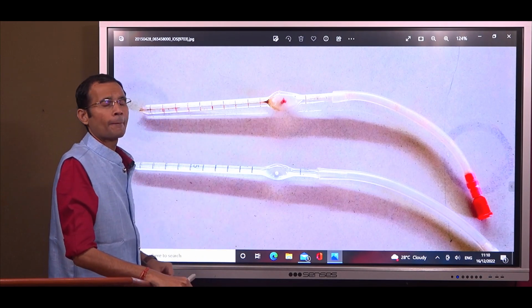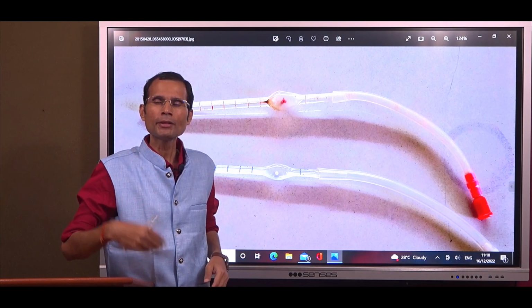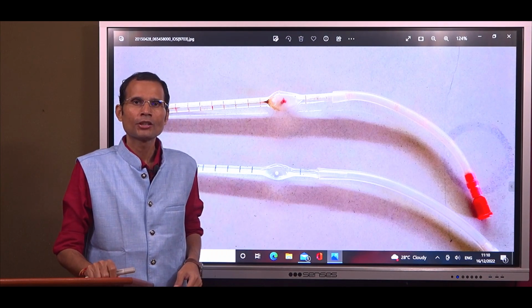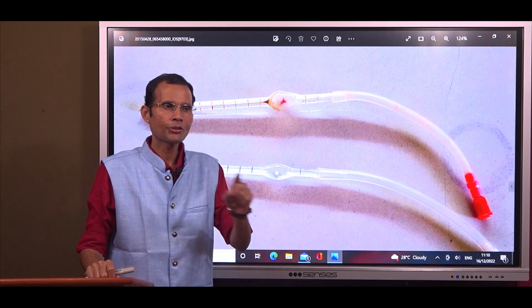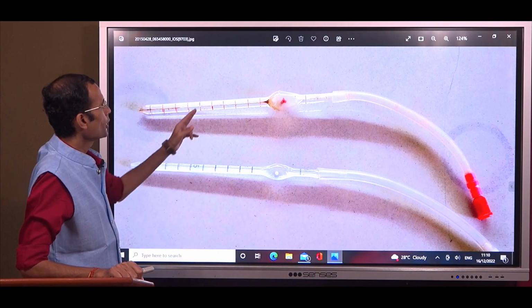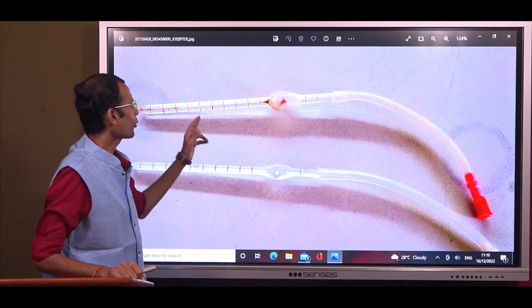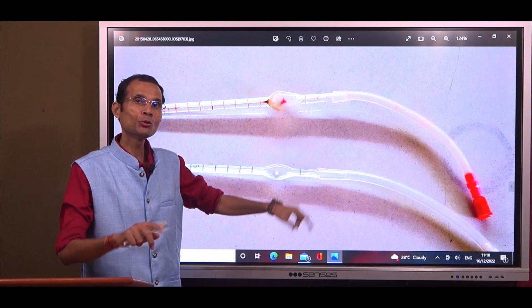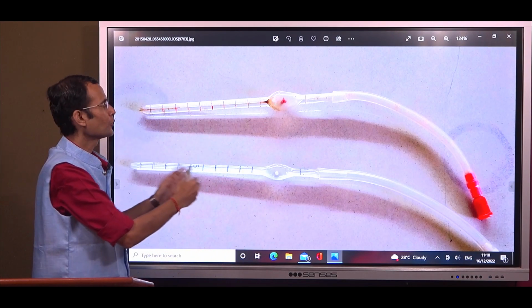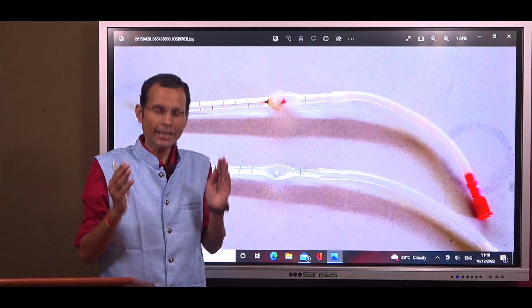Remember this. I repeat once again, because very often even the tutors tend to go wrong while explaining this. You know what is the error made by some tutors and therefore the students? They tell the students 0.5 was diluted to 101, therefore 1 part is diluted to 202, and then discard the first 2 drops to make the dilution factor 200. No, that's an incorrect explanation.